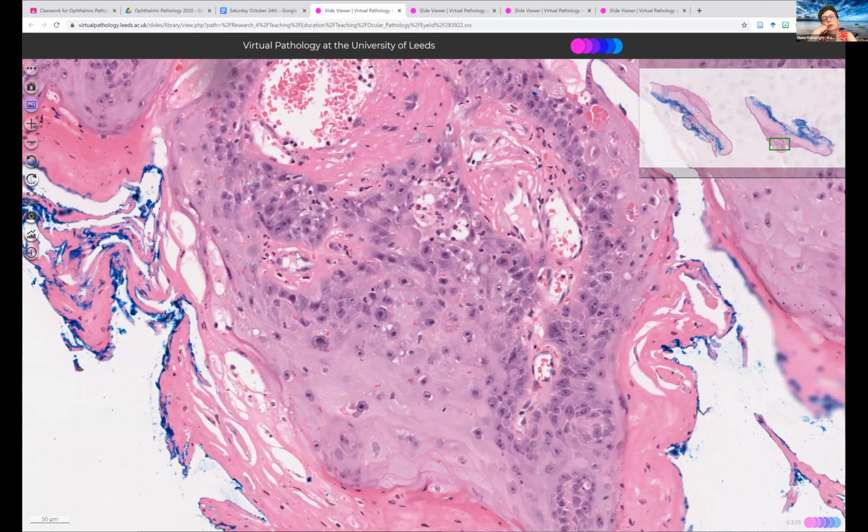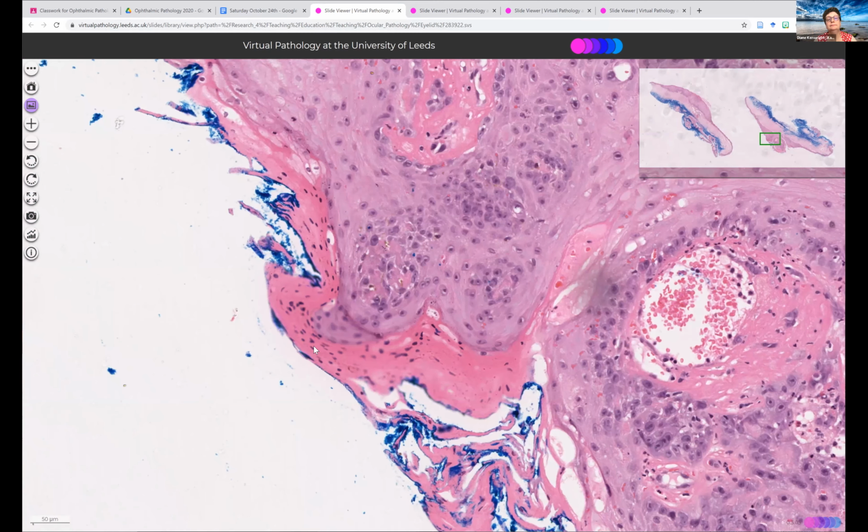What are the dots and specks on the surface cells? I think we're talking about the parakeratosis. Yes. Well, there are long ones and there are round ones, right? As a squamous cell undergoes normal maturation, they should lose their nucleus and become anucleate squames. Here, as the squamous cells are abnormally maturing, they are retaining their nucleus, and this is called parakeratosis.